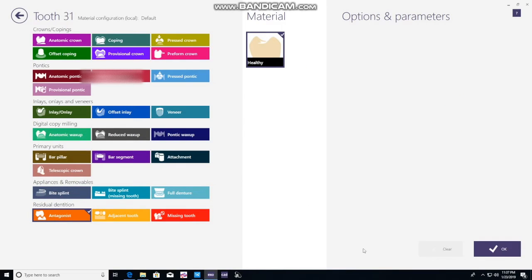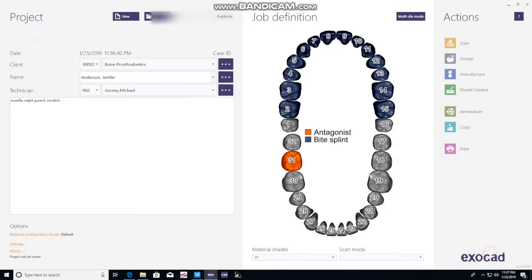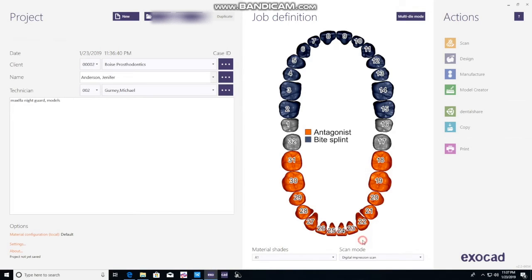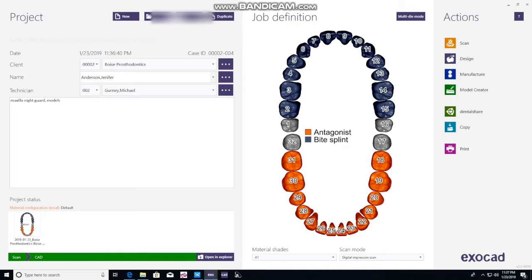This is the antagonist. Same thing — hold Shift and click on it, you're good. Here you're selecting where the data is coming from, in this case Digital Impressions. Then you'll hit Save and go straight to Design.